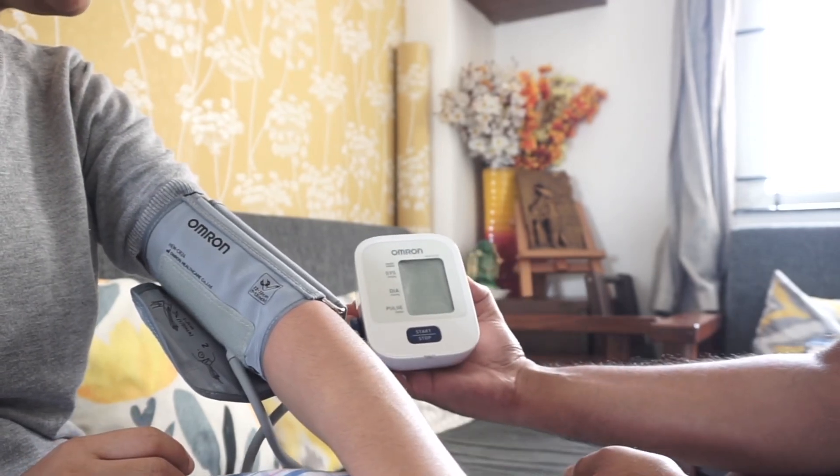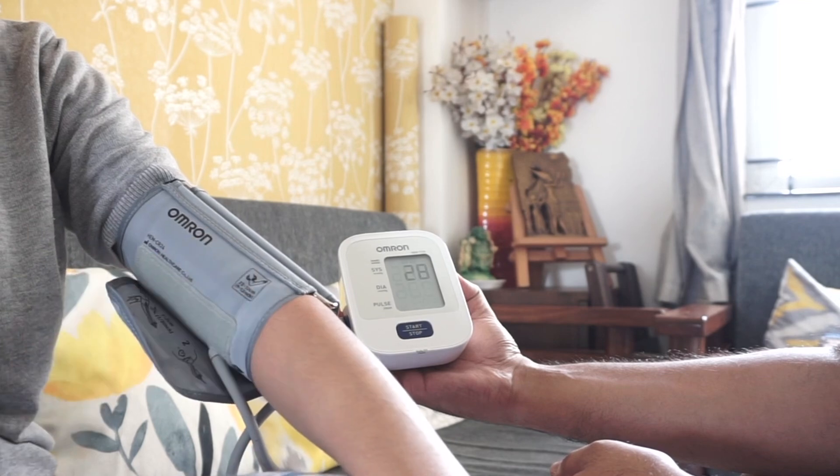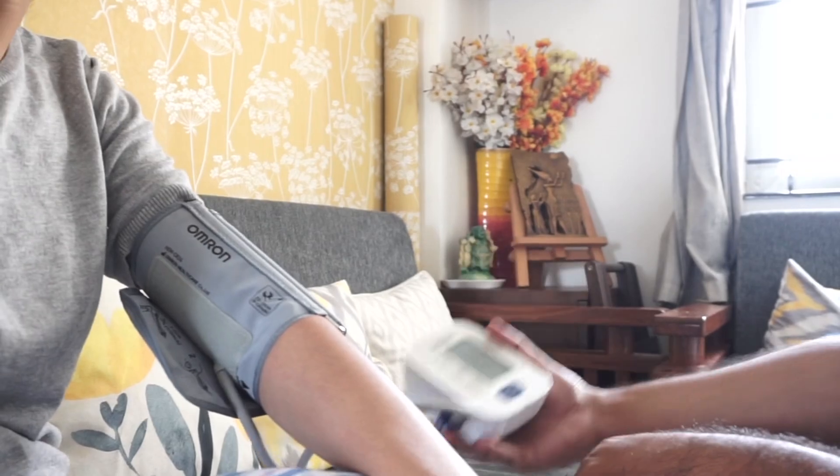Especially if you have elders or senior persons living with your family, I think this machine is mandatory to keep. For those who are suffering from blood pressure issues, it helps to monitor your blood pressure on a regular basis.